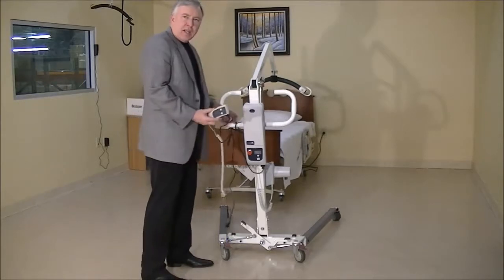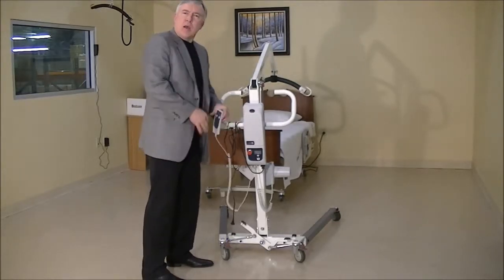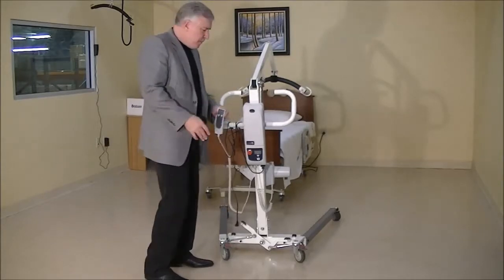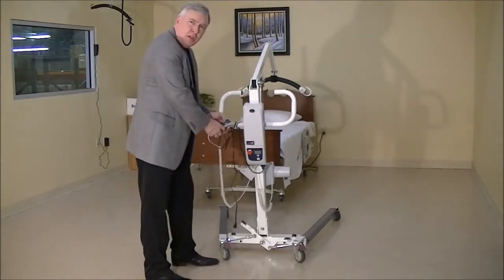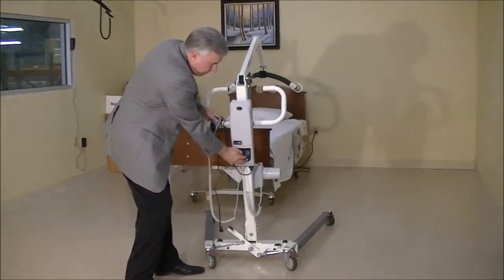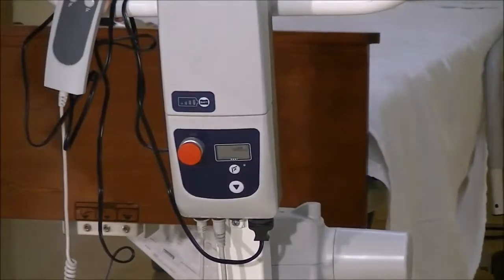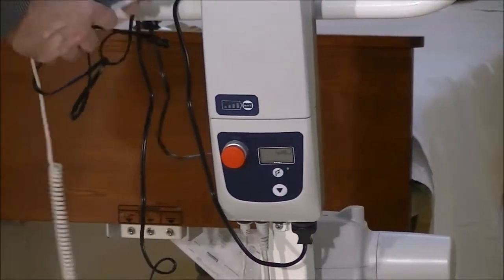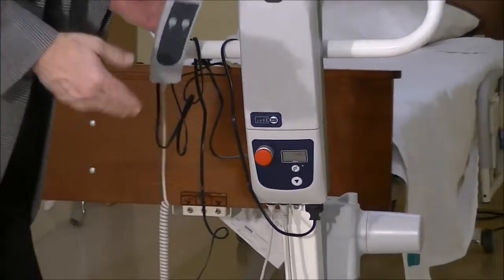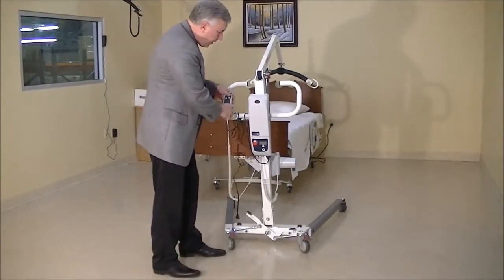There are times where you get a hand control that makes the lift go up and down and right out of the box, it's broken. To determine if it's good or bad: if you push the hand control and nothing's happening, go to the buttons on the control box and hit the up and down button. If that's making the lift go up and down but the hand control isn't, then you've got a bad hand control and it needs to be replaced to get the lift functioning properly.